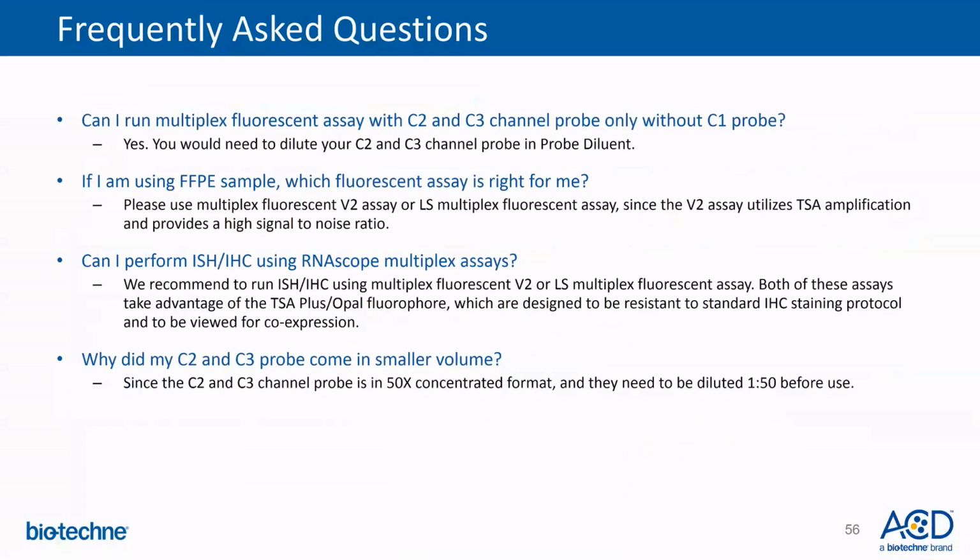Can I run multiplex fluorescent assay with C2 and C3 channel probe only without C1 probe? Yes, it is possible to do so. However, please note, since C2 and C3 probes are provided in 50x concentration, you will have to dilute them 50 times using the probe diluent.